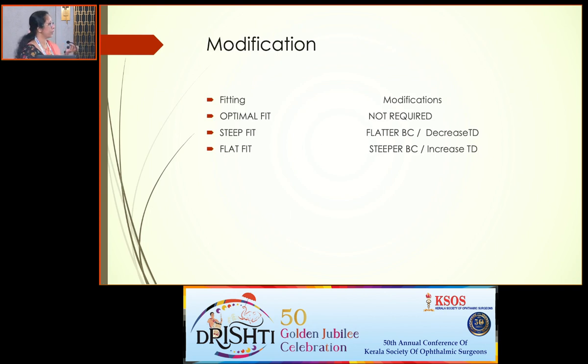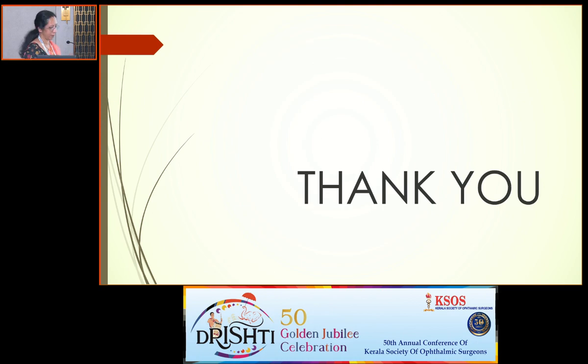So accordingly, based on the trial you have done, you can modify the prescription. If it's an optimal fit, no modification is required. With a steep fit, you order a flatter base curve, and with a flat fit, a steeper base curve can be ordered. Thank you.